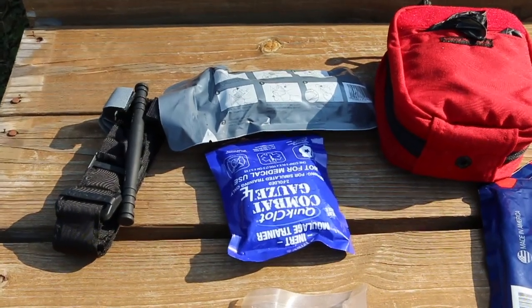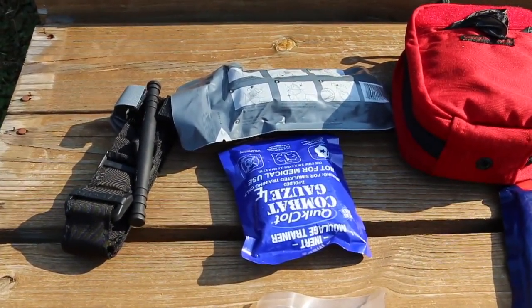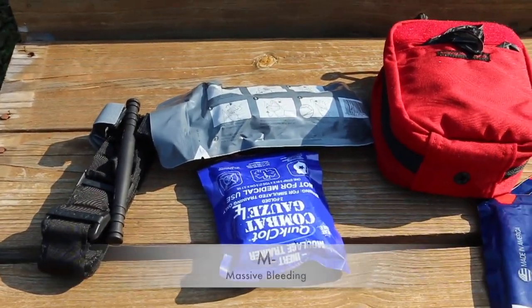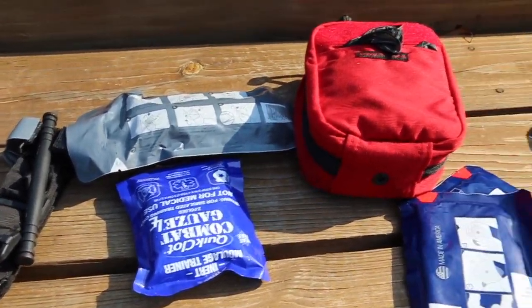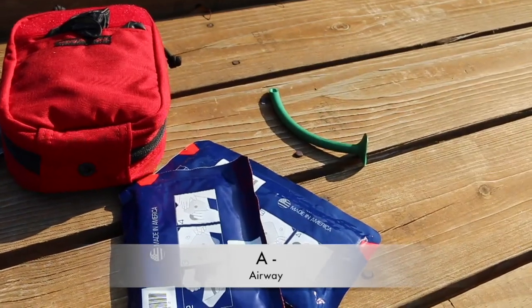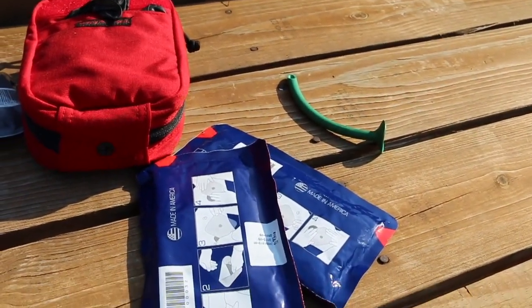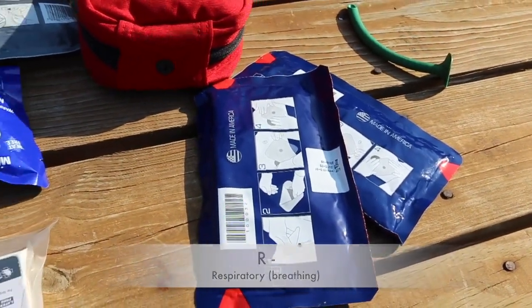Alright, so we're going to be using the MARCH algorithm to treat our patient. So the first thing in the MARCH algorithm is to control major hemorrhaging. So we're going to use the CAT tourniquet, we've got an Israeli bandage there, and we've got some combat gauze we're going to use to control major hemorrhaging. Then you go to A, which is airway. So we're going to use the NPA, show you how to insert that to support someone's airway. And then we go to breathing, so I'm going to use the HyFin chest seals to show you that.